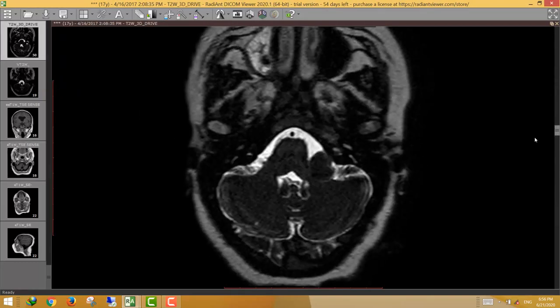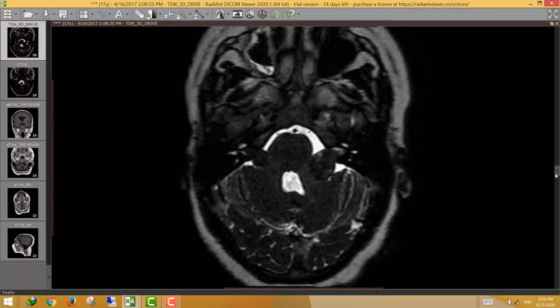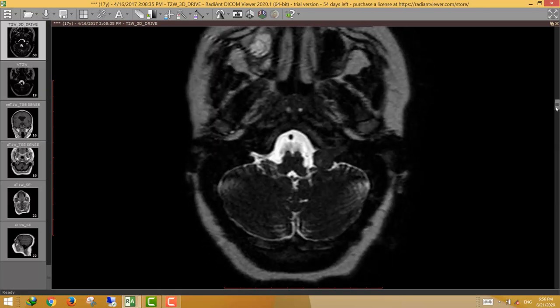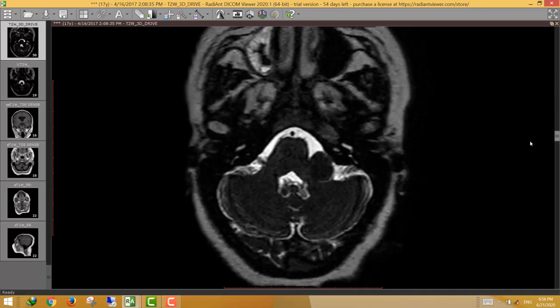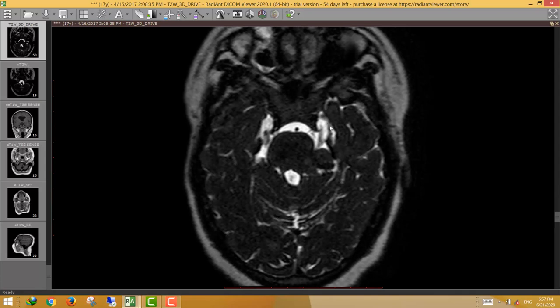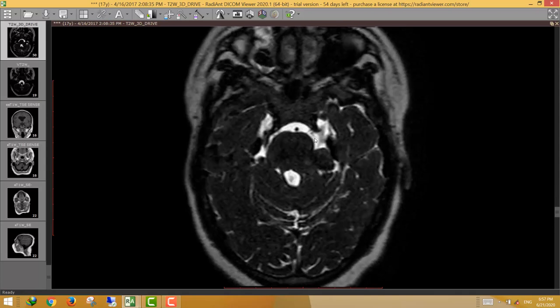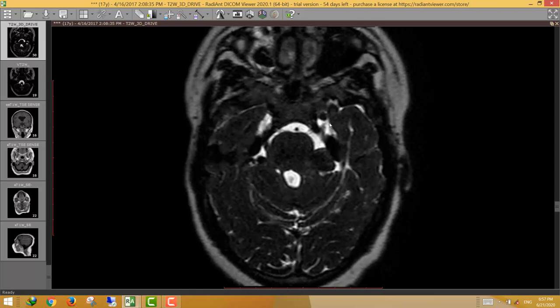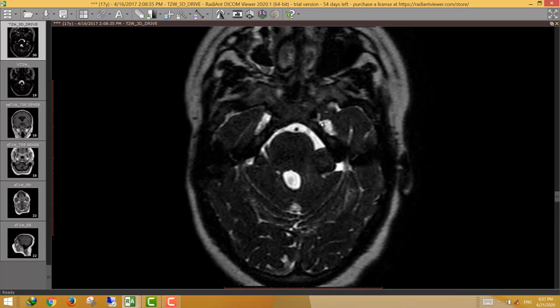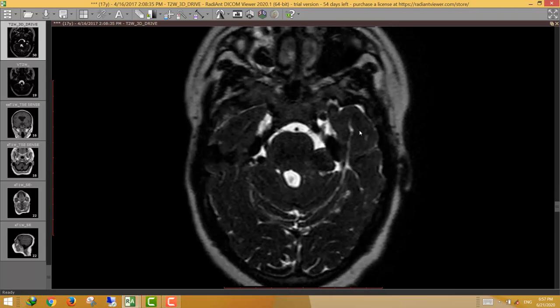You can see multiple schwannomas: bilateral cerebellopontine angle schwannomas and left jugular fossa schwannoma. On the heavy T2 sequence for the CPA lesions, we can see Meckel's cave, the trigeminal nerve, and the small lesion along Meckel's cave representing another small cranial nerve schwannoma.